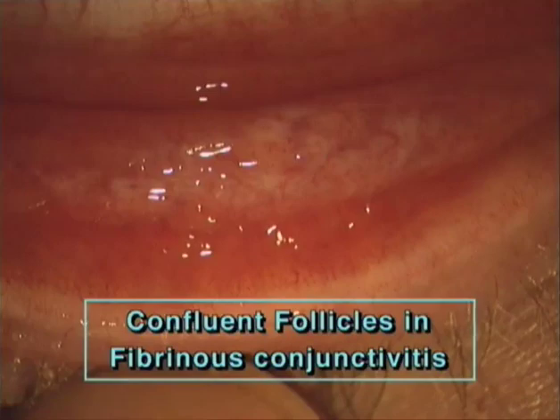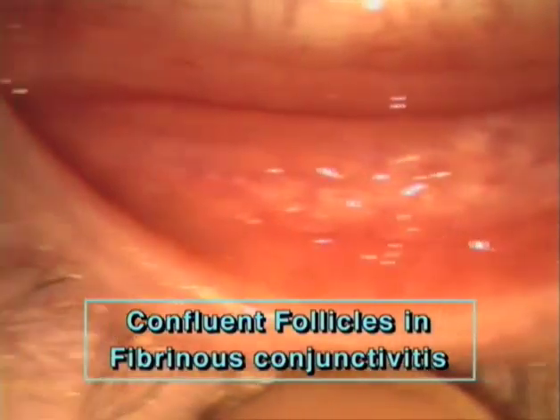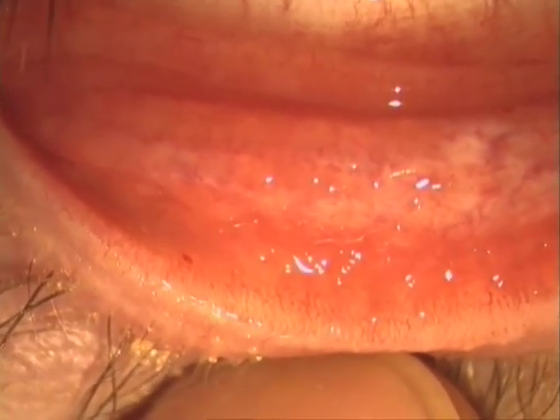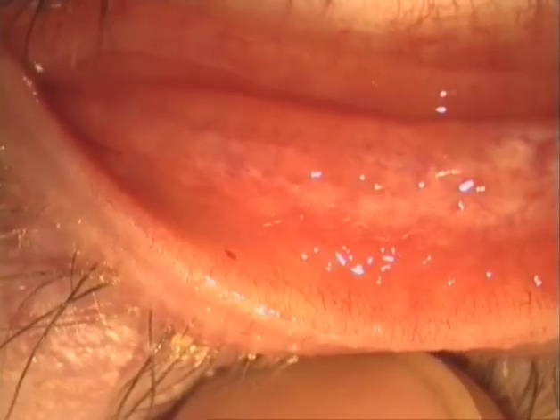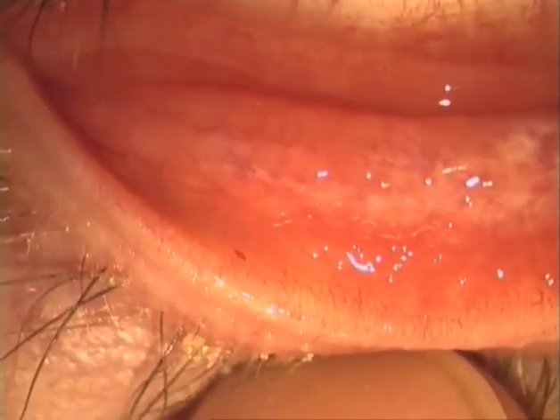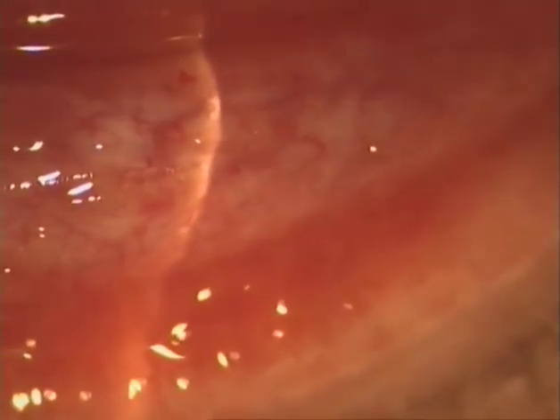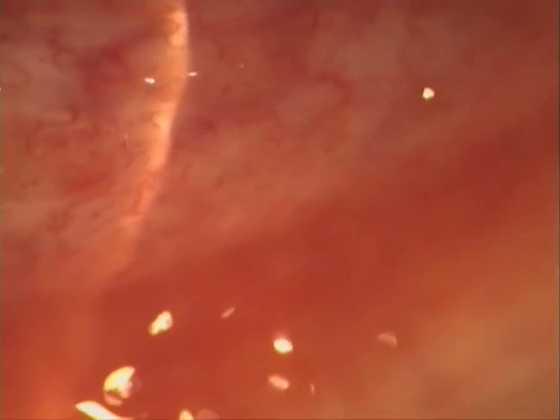Confluent follicles. In this case of fibrinous conjunctivitis, the individual follicles are less conspicuous because they are confluent. They do not stand out as a carpet of single globules, but have coalesced into two rows extending along the conjunctival folds. A few single follicles are found only here and here, with their typical homogeneous core and the vascular corona. But if we move to the row of confluent follicles, we find their central mass propagating less light because this central mass is less transparent.